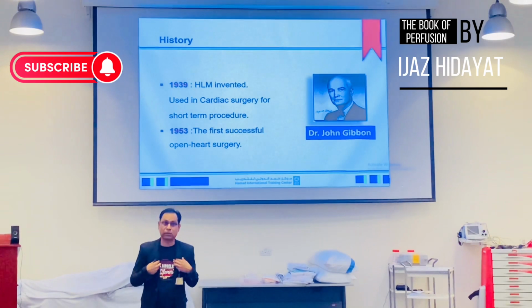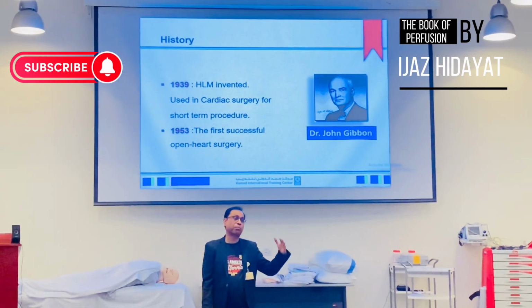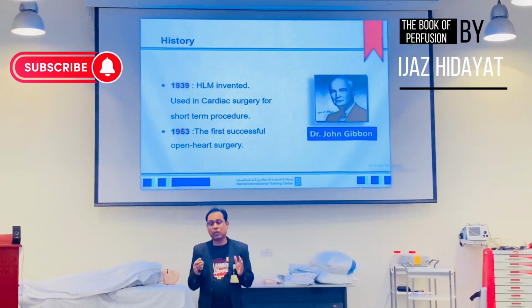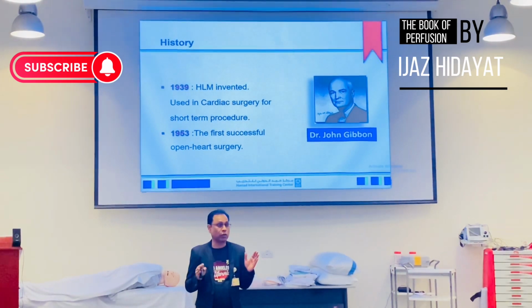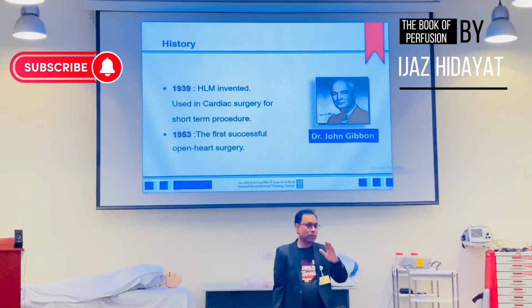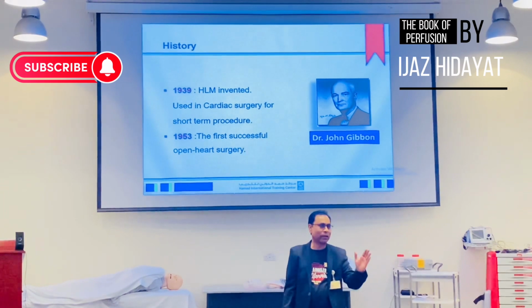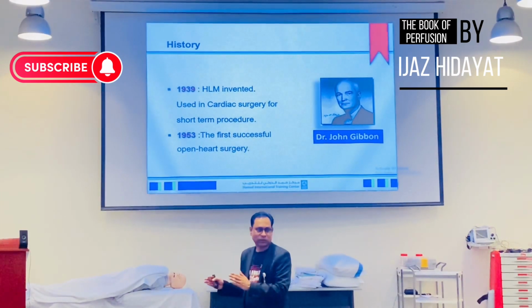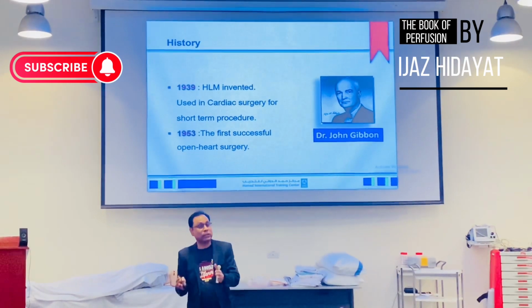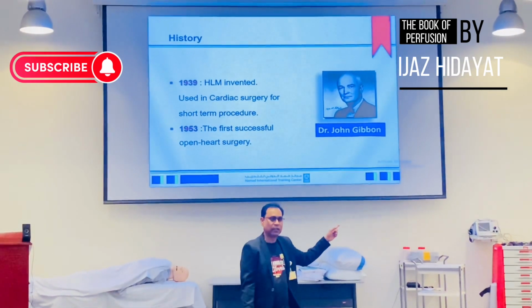Basically the perfusionist is the person who takes care of the heart and the lung during bypass surgery, and ECMO is a part of bypass surgery actually. So the HLM machine was invented by Dr. John Gibbon and actually operated by his wife. So never forget the females. Females have an active role in every moment of life. The surgeon was thinking to invent the machine, but the machine actually was run by the wife of John Gibbon, who is the surgeon.